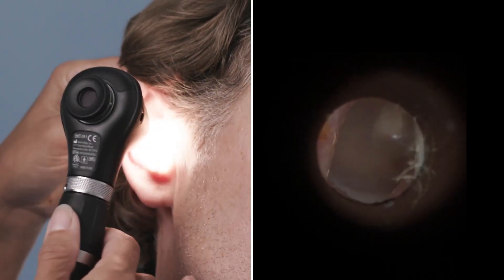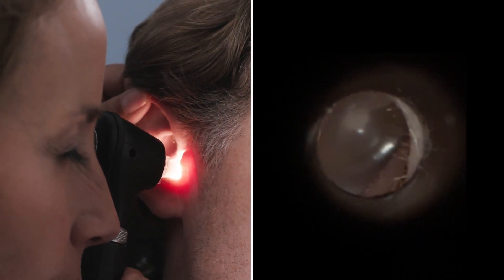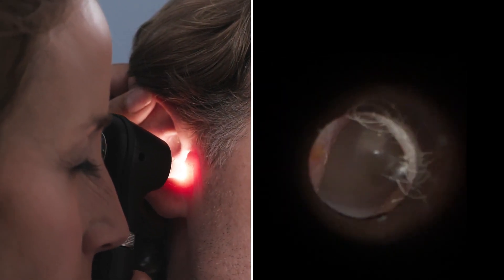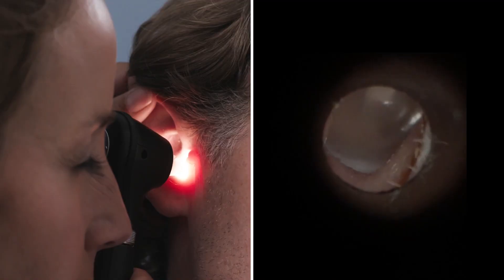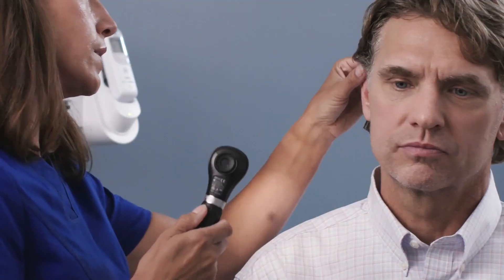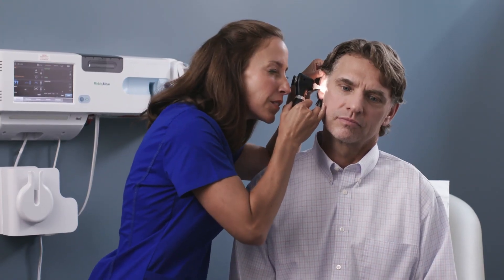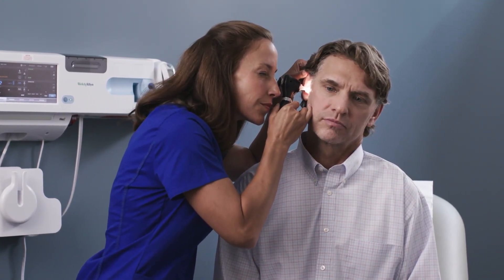It's best practice to examine the healthy ear first. This allows you to see the patient's normal ear anatomy, compare the other ear, and help prevent the spread of infection. Straighten the outer ear canal to make insertion of the speculum easier. For adults, retract the pinna upwards and backwards. Guide the otoscope into the patient's ear to view the canal and tympanic membrane, adjusting the position as needed to get a complete view of the entire canal and all areas of the tympanic membrane.